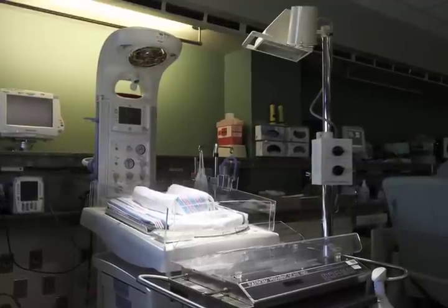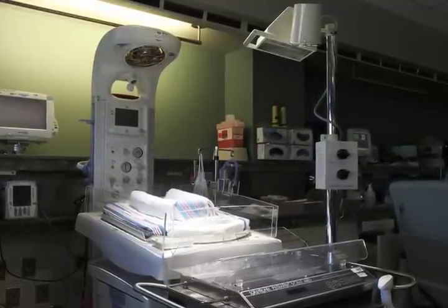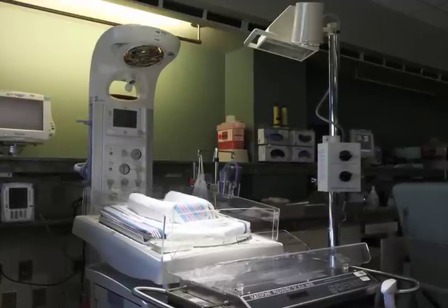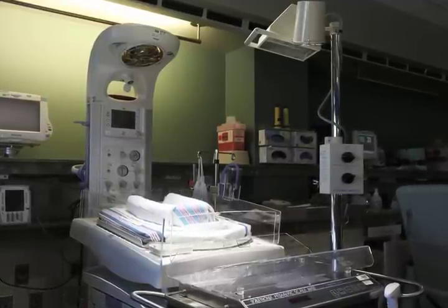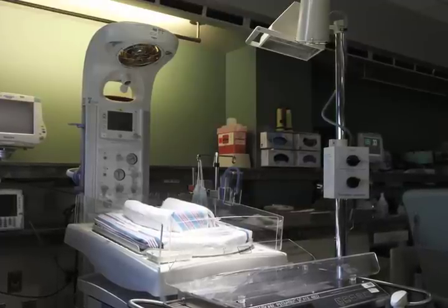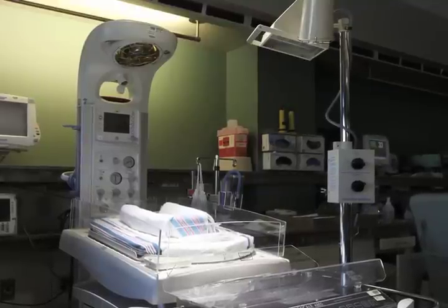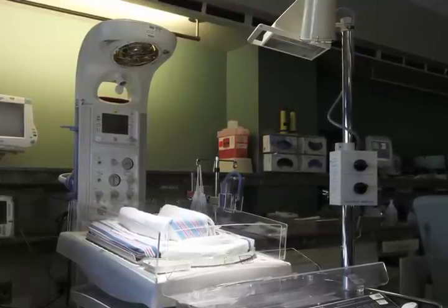A radiant warmer bed, pictured here, is a typical bed used during the admission of a baby until the baby is ready to be moved to another type of bed. This bed allows for easy access to the baby by medical staff. The baby's body temperature is monitored by a probe, while an overhead warmer helps to keep the baby warm. A heat lamp at bedside can also provide heat for the baby, as well as an additional light during bedside procedures.